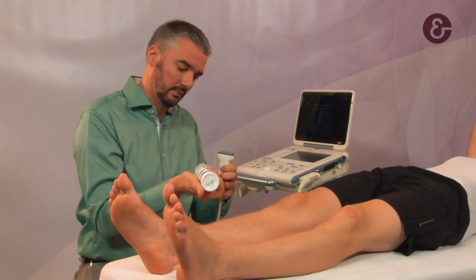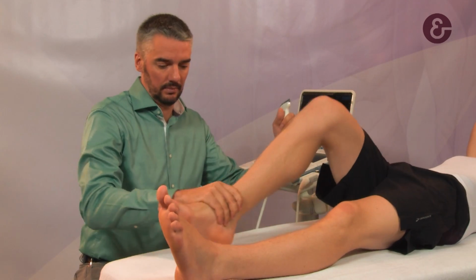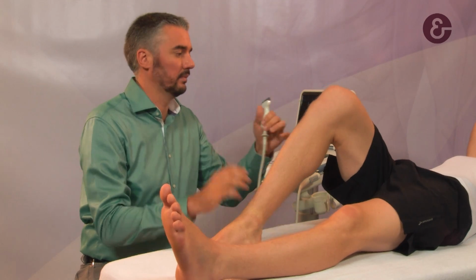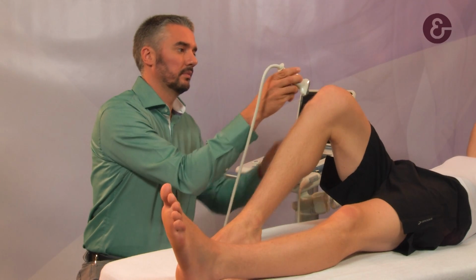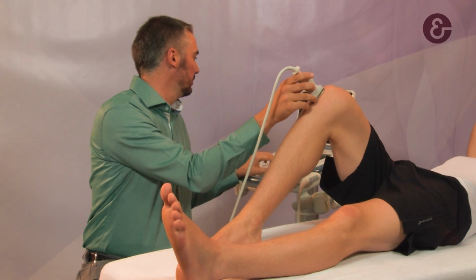Let's adjust the settings of the system and assess something other than muscle. Let's have a look at the patellar ligament. Ligaments should be scanned while on stretch, therefore this knee flexion.